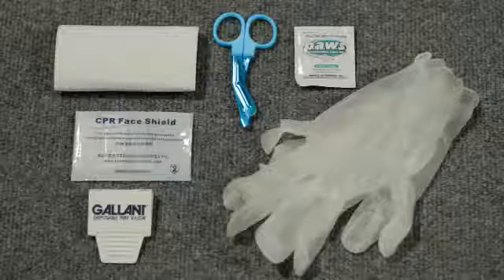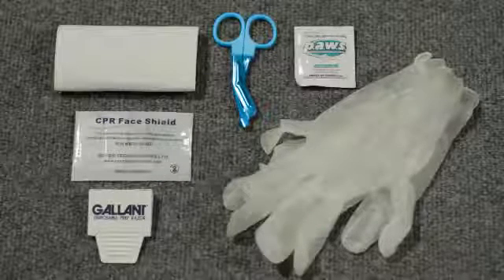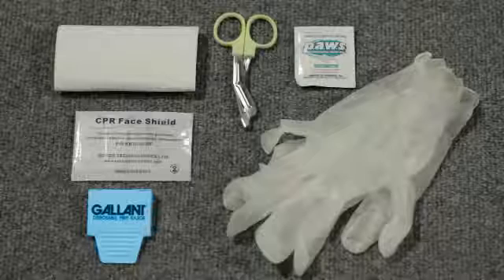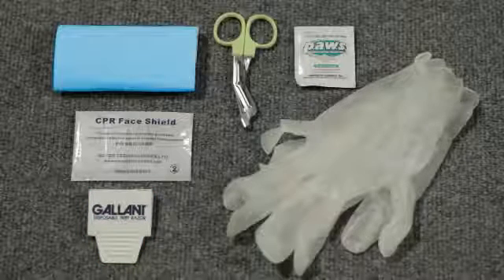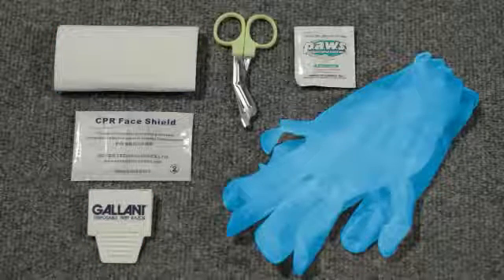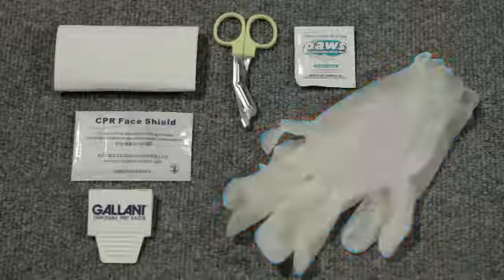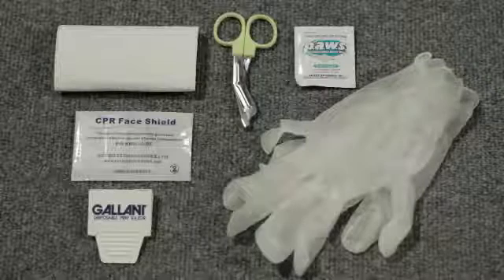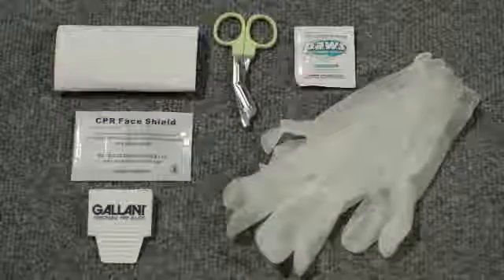A rescue accessory package is attached to the electrode pads, which contains a barrier mask for giving rescue breaths, a small pair of scissors for cutting clothing if necessary, a moist towelette for cleaning up, a razor for shaving any chest hair, a paper towel for drying the victim's skin, and a pair of non-latex gloves to protect your hands. In a real rescue, of course, you would use all these items if needed. For training purposes, we won't use them in this exercise.